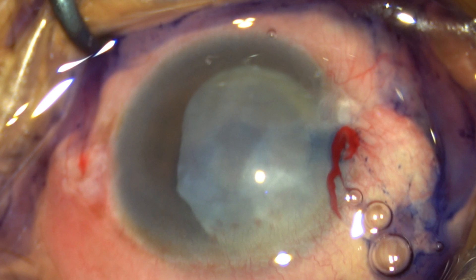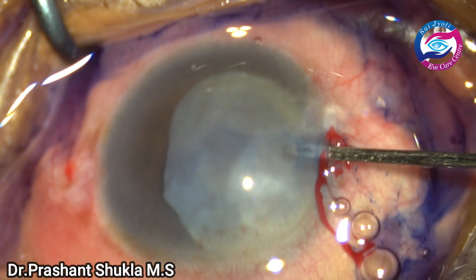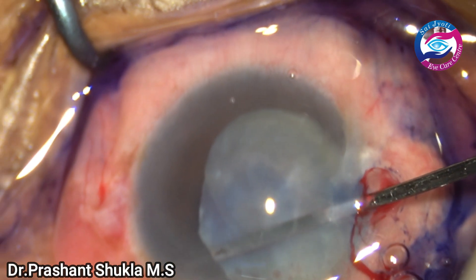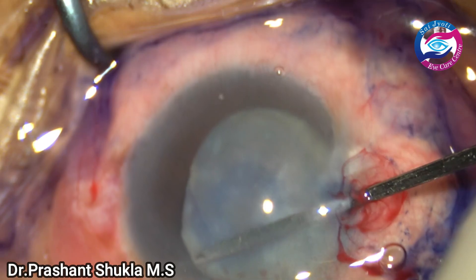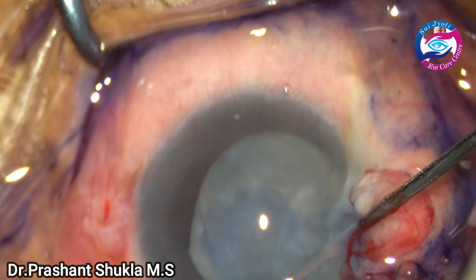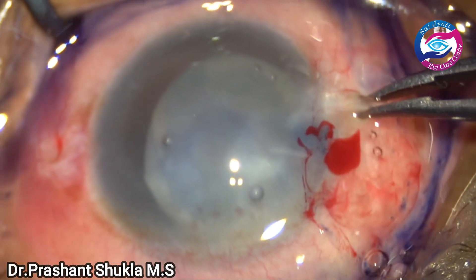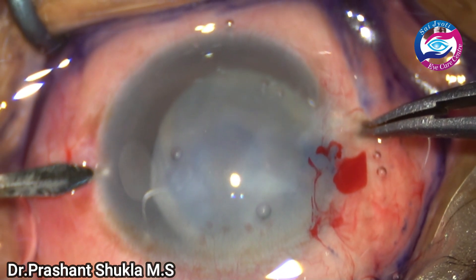A side port has been made, the anterior chamber has been stained with trypan blue, and viscoelastic has been instilled into the anterior chamber. Here I am using a cyclo-dialysis spatula or iris spatula — a depositor kind of instrument — just to release the posterior synechiae from the anterior lens capsule. It's a very swift movement below the iris; the capsule and iris attachments are loosened up, and one more side port is made.